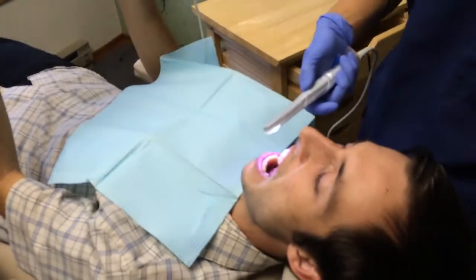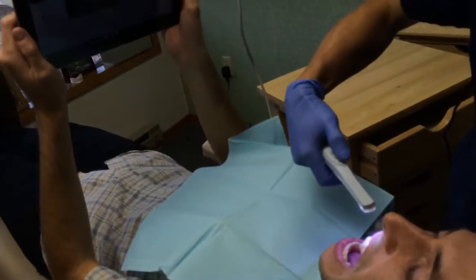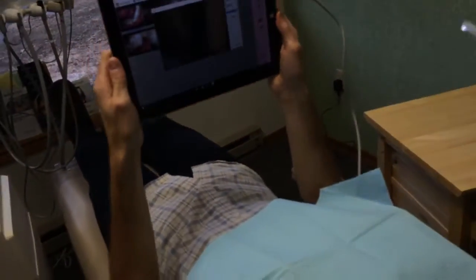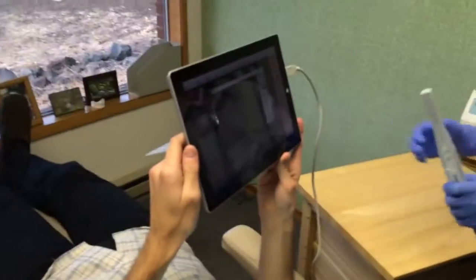Anyway, I think it takes a little bit of learning to orient things, but once you've got it down, I think it should only take an afternoon just playing around with it. Okay, it's good, guys. Now the next step is I want to show you a little bit about the photographs and stuff like that.